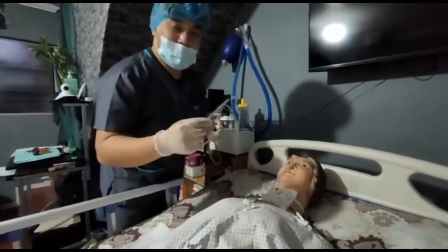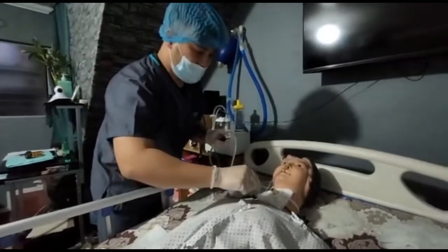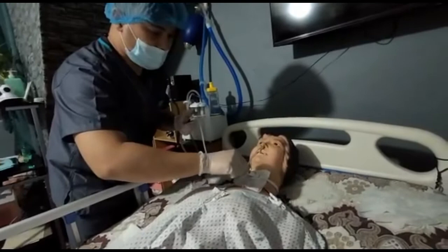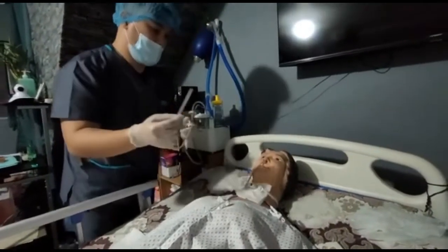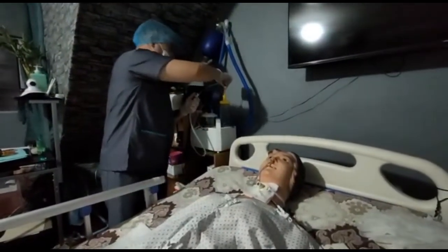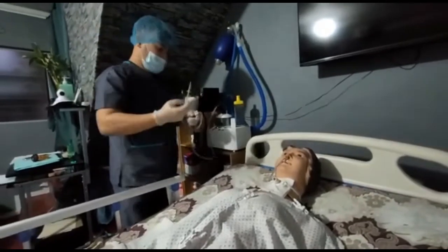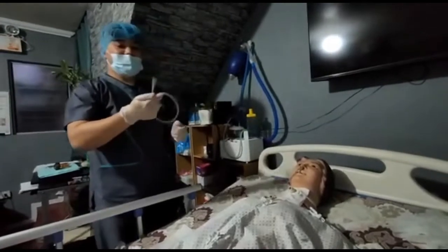Okay, so pagpasok po natin sa kanyang circular motion, 10 seconds lang po siya. 1, 2, 3, 4, 5, 6, 7, 8, 9, 10. Then i-release po natin siya. And i-repeat po natin as necessary. Kung konti lang naman po, pwede na po yung isa. So, ang pagdi-dispose po ng ating catheter, isasama na natin siya sa gloves.